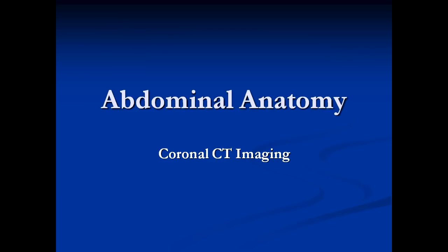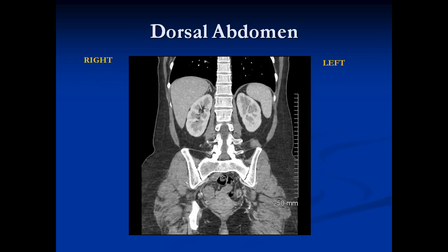If we turn the study around and do what we call coronal imaging, it gets a little easier to see what we want. Most CT scans nowadays are 16 or 64 slice and can easily recreate images in coronal or sagittal format. Going to the very back of the abdomen and looking at the retroperitoneum, we can see both kidneys surrounded by fat. It's very important to remember that because that fat allows us to see these structures on a plain film of the abdomen as well.